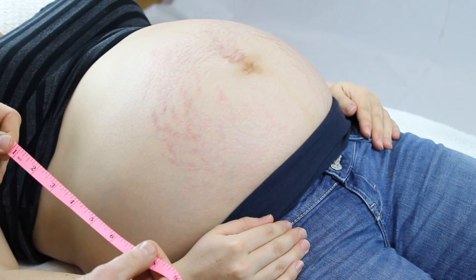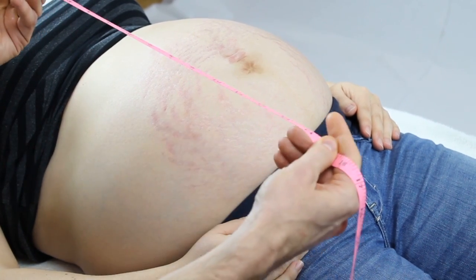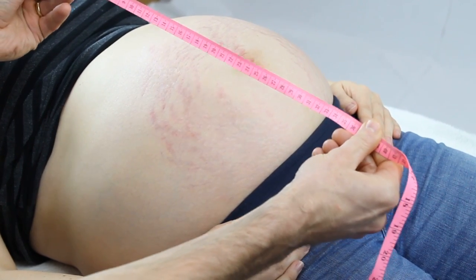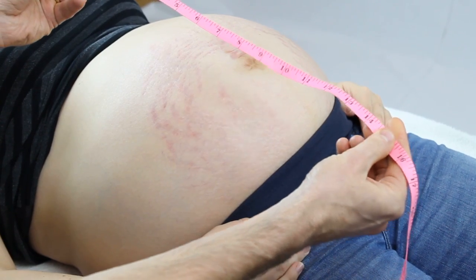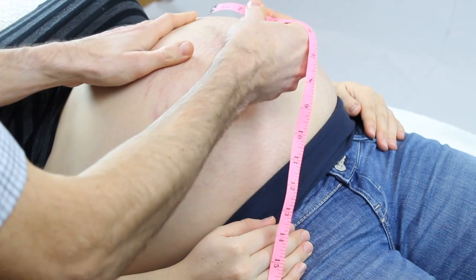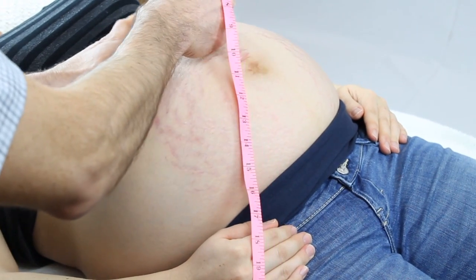Using a non-elastic tape measure, turn the tape so that the scale you will be reading from is facing the baby. Start with the zero at the fundus of the uterus on the fetal pole and measure down to the symphysis pubis.